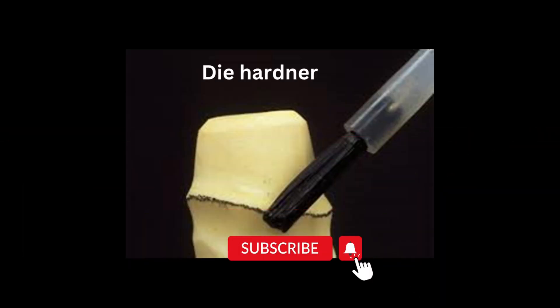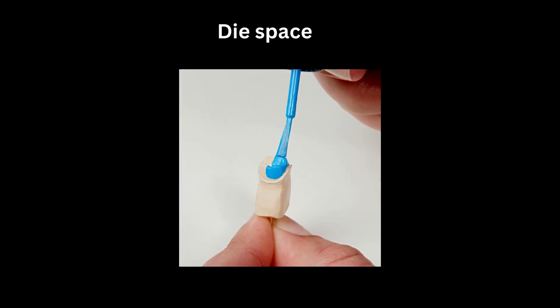Next, we apply a dye hardener to improve the surface hardness. Once it's dry, we apply a dye spacer. This provides space for the luting cement — meaning it gives space between the crown and the tooth so that there's enough room for the luting cement when we go to cement the crown.